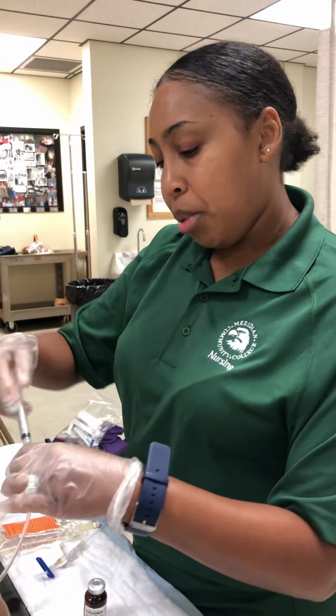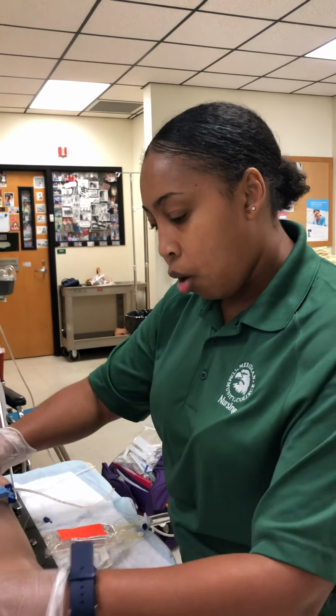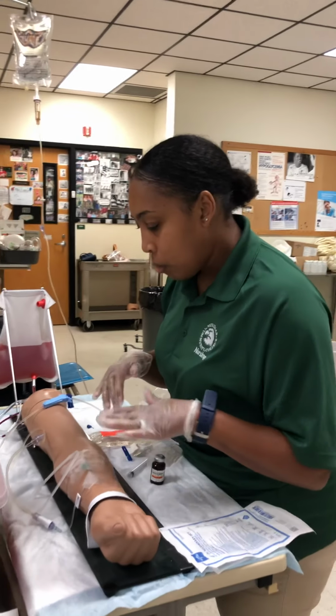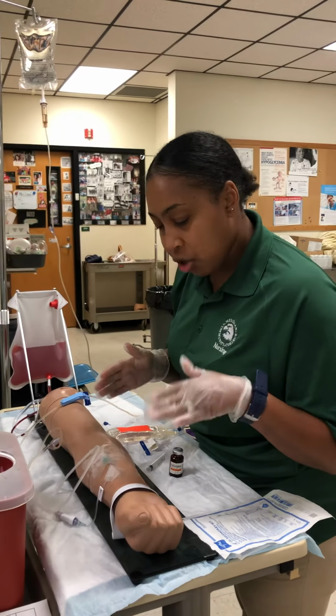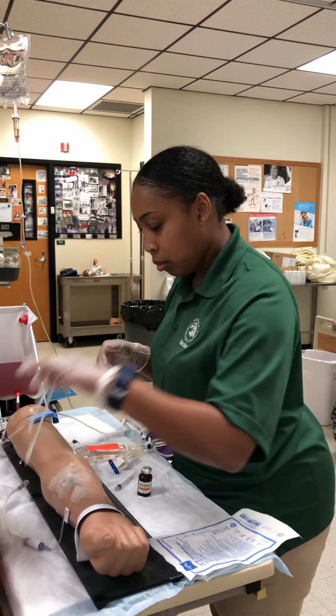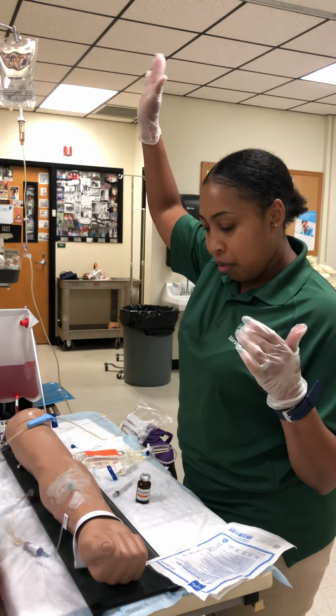Okay, so now we're going to unpinch. We'll discard our syringe. We'll be monitoring our patient for any signs and symptoms of adverse reactions when giving it. We're going to ask our patient how they tolerate it. We'll sign, we'll document. Now we're going to get ready to proceed with our IV Piggyback.